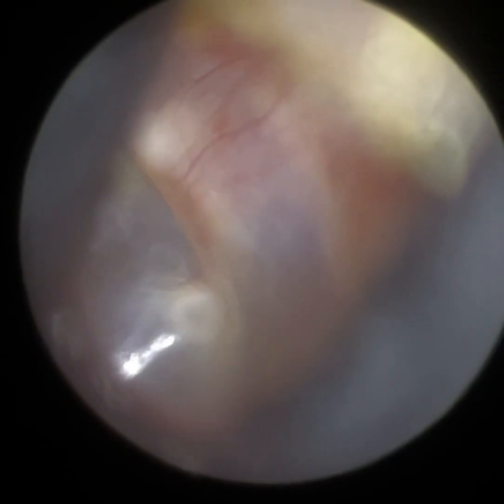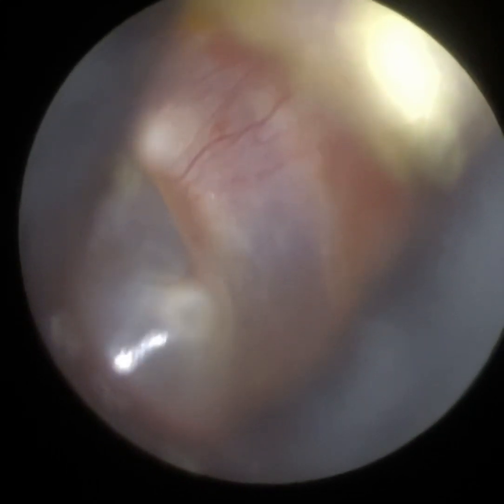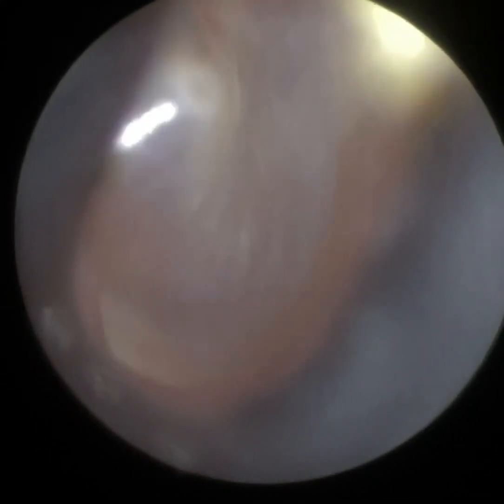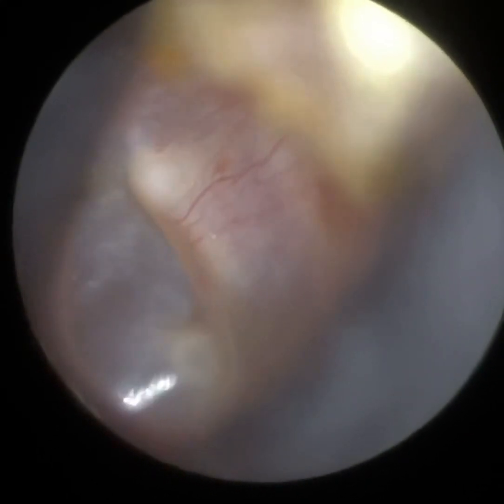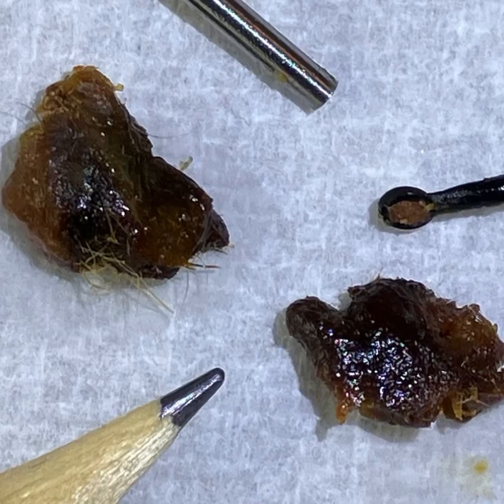This is the patient's left ear again — quite a narrow ear, but even then we've got a great view. Just adjusted the focus slightly. You can see all the blood vessels and capillaries to the back part of the ear canal and the eardrum. And that's the contents from both ears. I hope you enjoyed that video, and if you are interested in the Waxscope, please do email info@clearwax.co.uk. Thank you, bye.